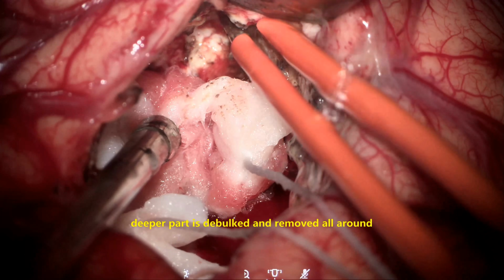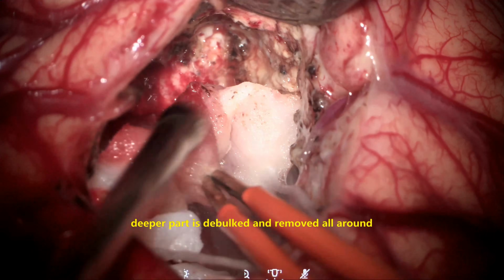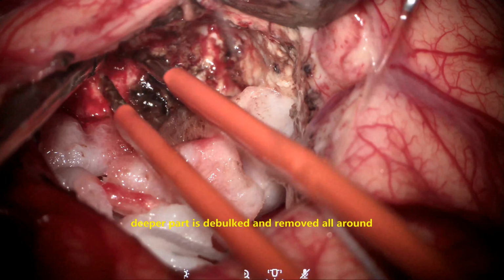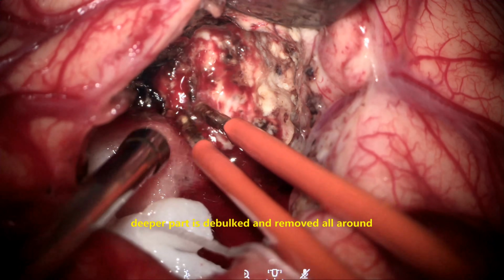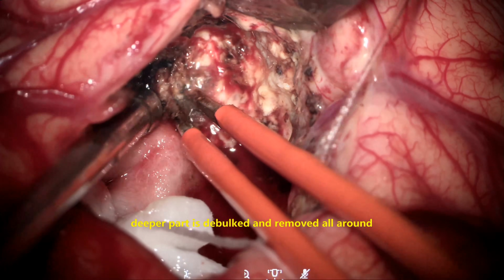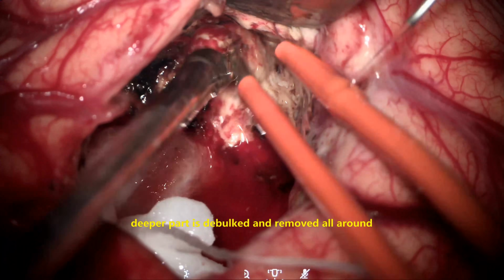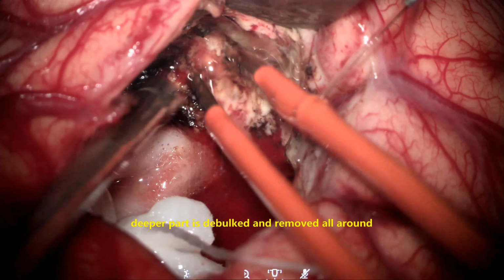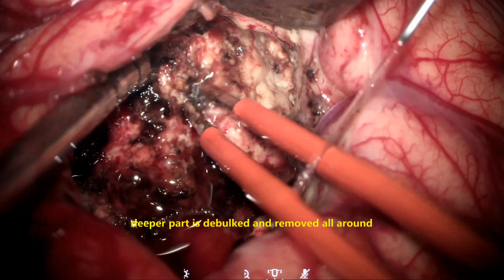At this stage, we ask the anesthetist to raise the blood pressure 30 to 40 millimeters more than the induction blood pressure. Wait for about 10 to 15 minutes so that we confirm there is no bleeding at the tumor bed, which is of utmost importance in cases like this large vascular necrotic tumor.